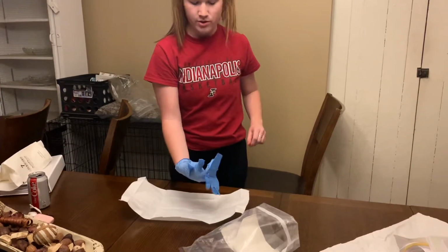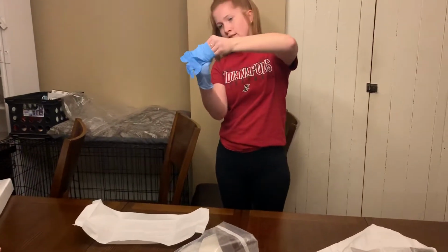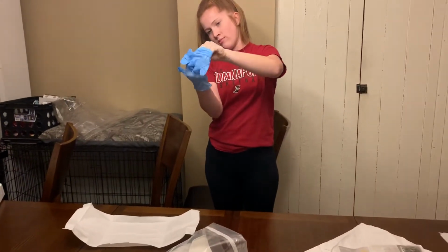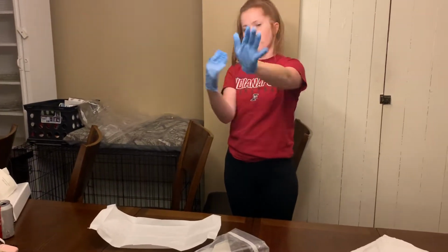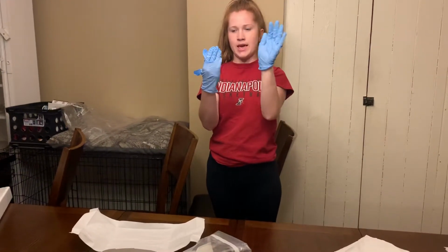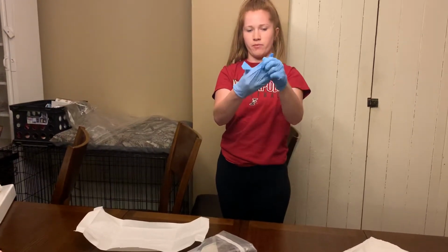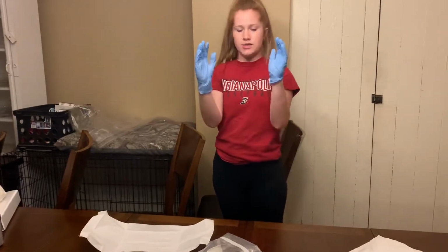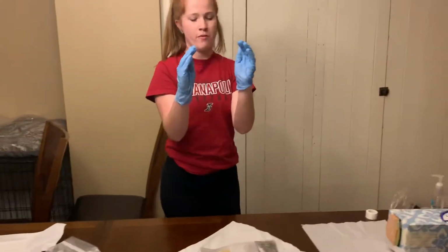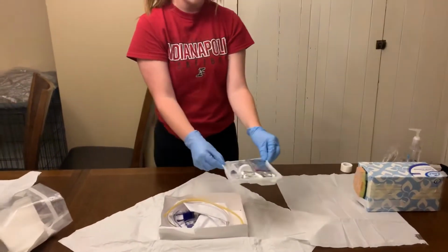So I'm going to grab underneath the cuff and step back, trying to keep my hands, again, above waist height, but with my working space, it's a little bit difficult. Okay, so I have that glove on, and since this hand is now sterile, I can fix my fingers in the glove. Okay, so now that my hands are sterile, I'm going to keep them above my waist, and I'm going to then take my catheter kit.